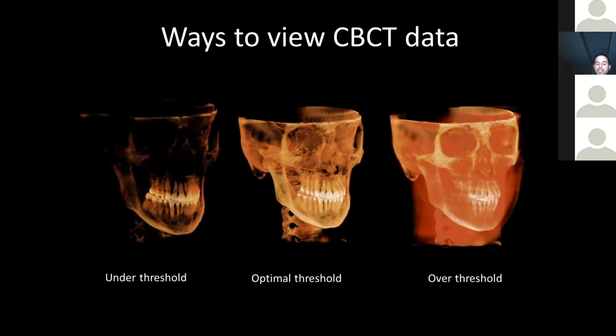And most of the time it gets close, but as we'll see in a little bit, the data isn't perfectly accurate, so we can't get a perfect rendering out of these scans, and you have to live with the best you can get. Right? And I actually think that's just as important as recognizing normal anatomy and pathology in reviewing one of these scans, is also recognizing what the limitations of the data are. Threshold setting limitations are one of those things you need to recognize and appreciate. Okay, so again, great for assessing kind of where things are in the patient, but if you need to look at details, you must go back to the slices.